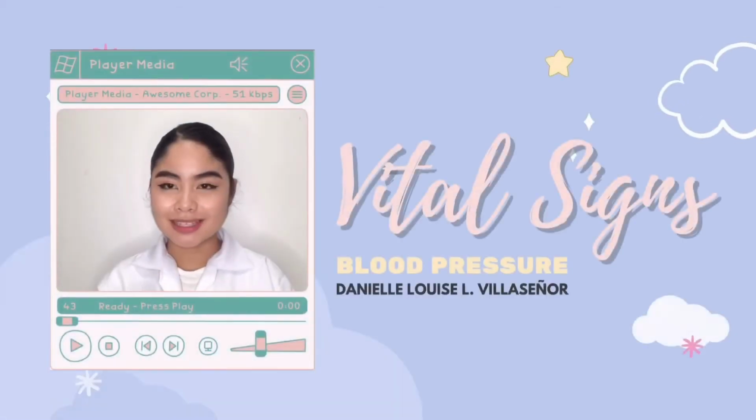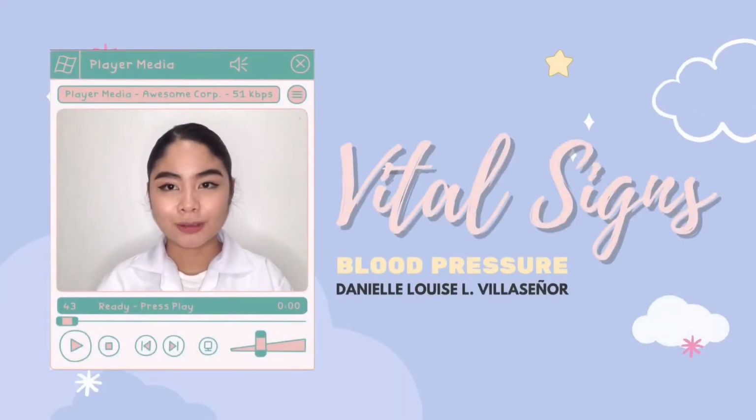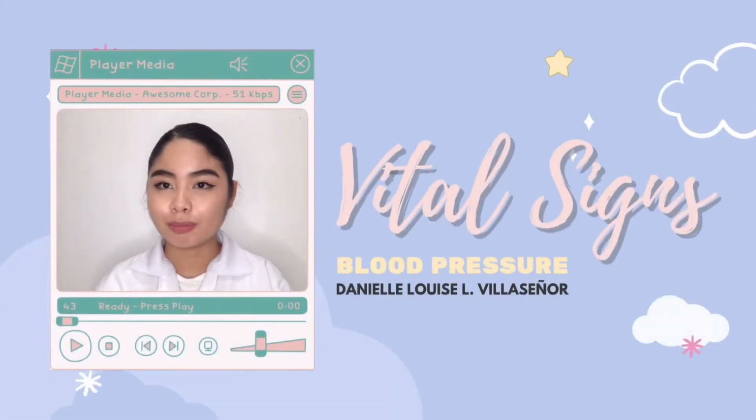Good day, my name is Danielle Louise Villaseñor from BSN 1B, and for this video, I will be performing or taking the patient's vital signs, specifically their blood pressure.